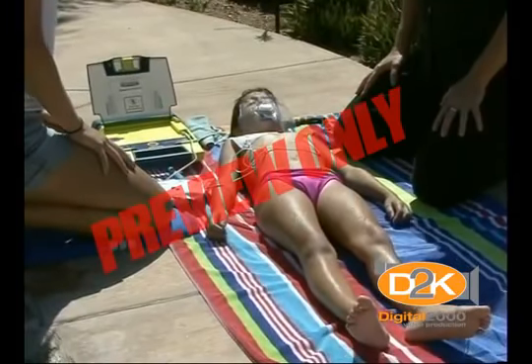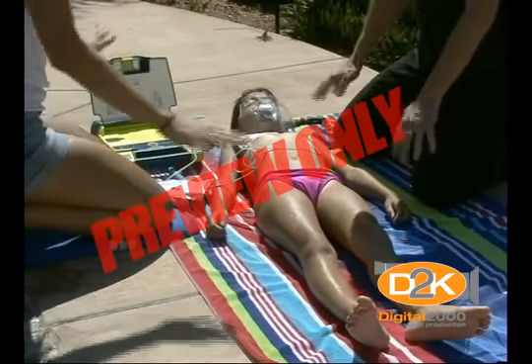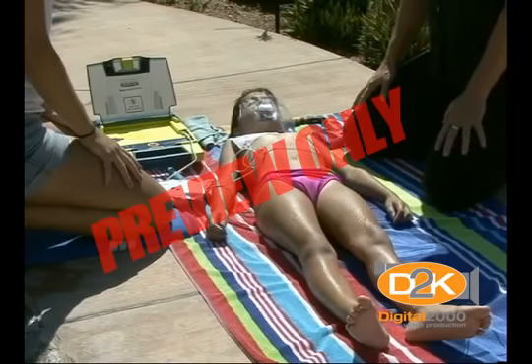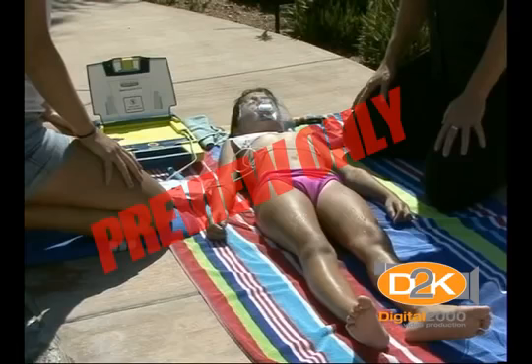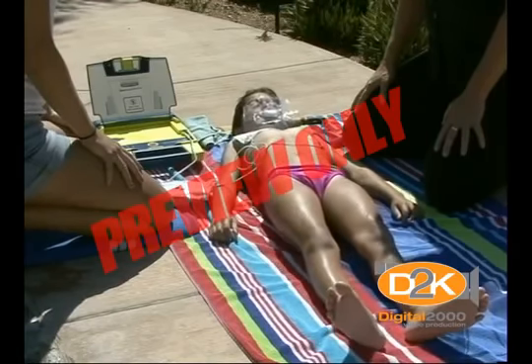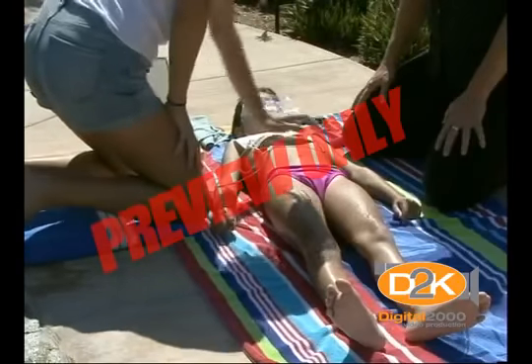Shock advised. Shock advised. All clear. Starting. All clear. Stand clear. Shock will be delivered in 3, 2, 1. Shock delivered. It is now safe to touch the patient.